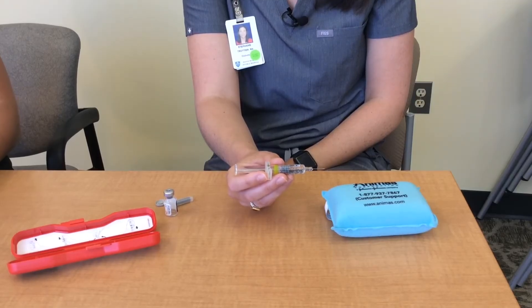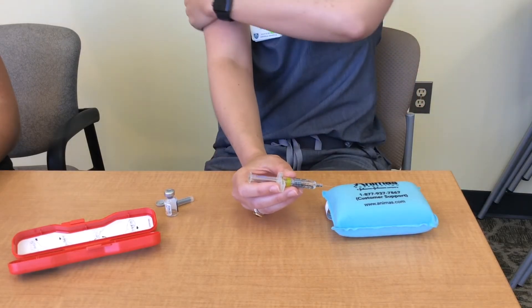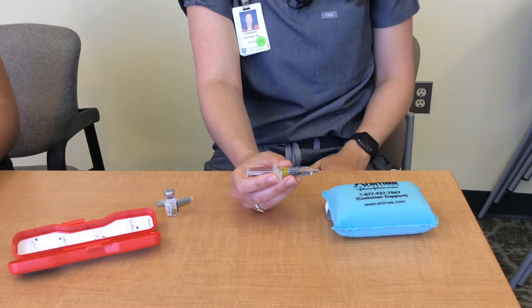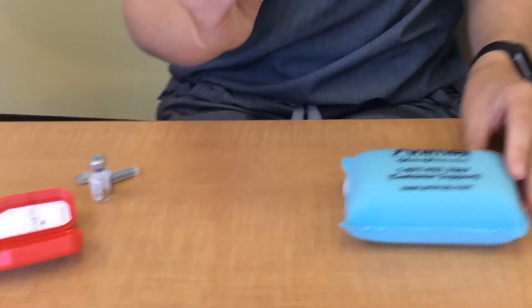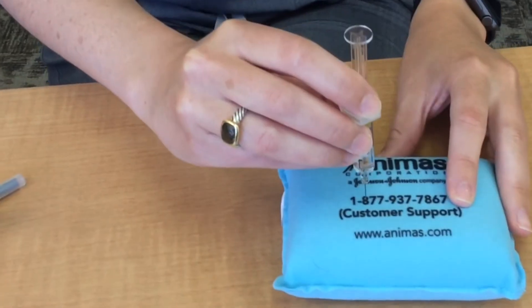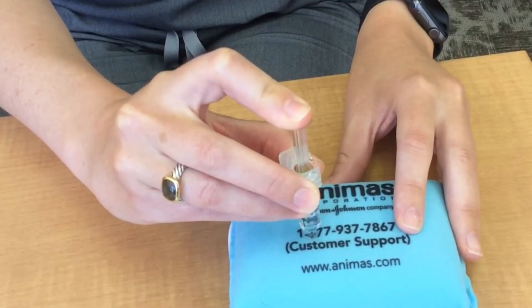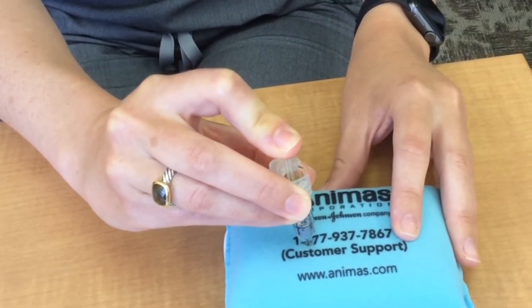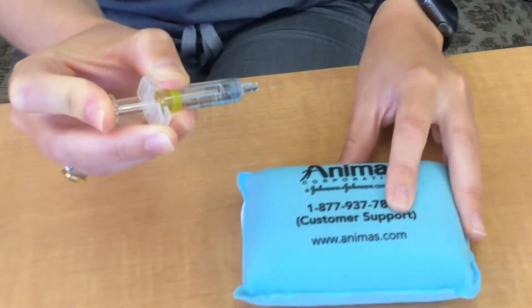You are now ready to inject the glucagon. Areas of injection include the back of the arm, the thighs, and the buttocks. Hold the syringe in your hand like a dart and insert the needle at a 90 degree angle and insert the solution into the muscle. For demonstration purposes we are using this training injection cushion. Remove the needle and place back into the container.